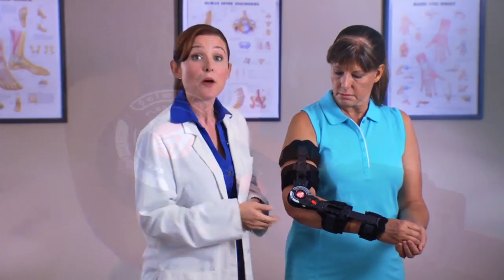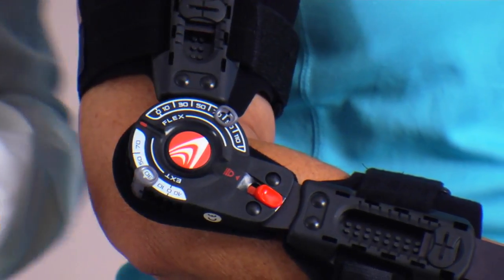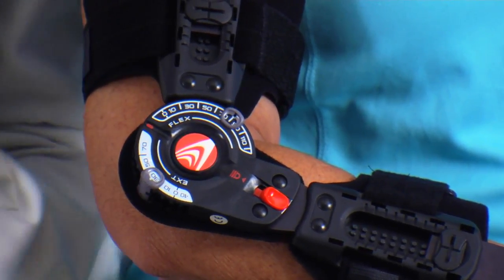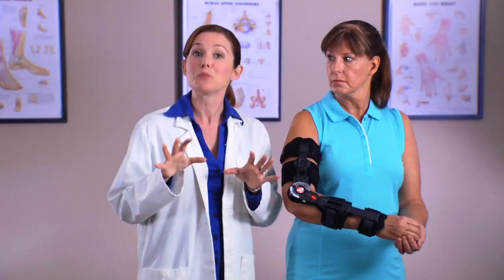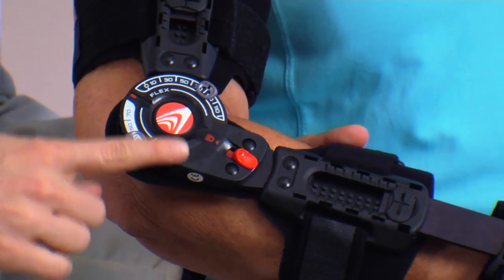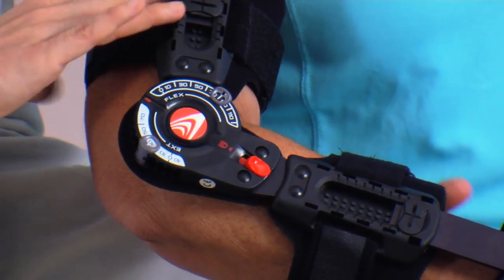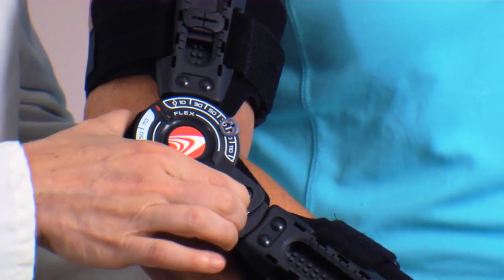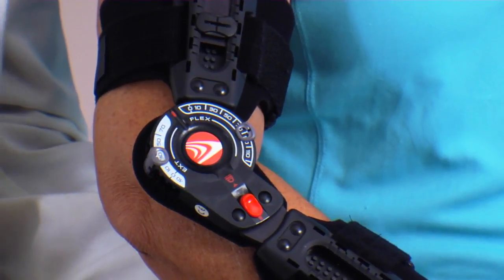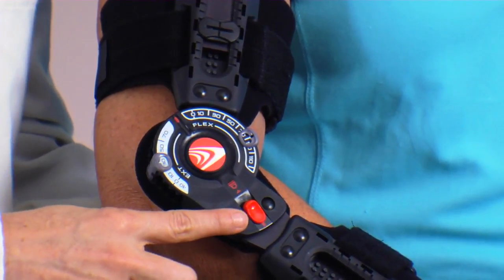To adjust the flexion settings, pull the tab out away from the center of the hinge and slide it to the desired position. Make sure the tab is secured in the correct position. To prevent range of motion, lock the T-Scope Elbow Premier Brace by sliding the hinge lock towards the center of the hinge after positioning the arm at the appropriate angle. The hinge may be locked by sliding the red quick lock button into the locked position at any setting.